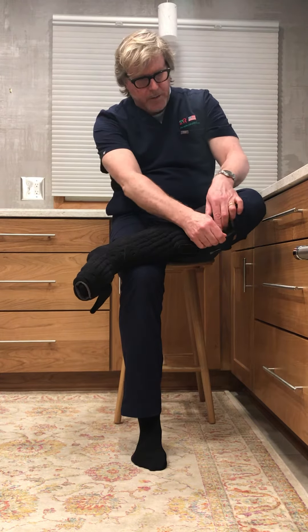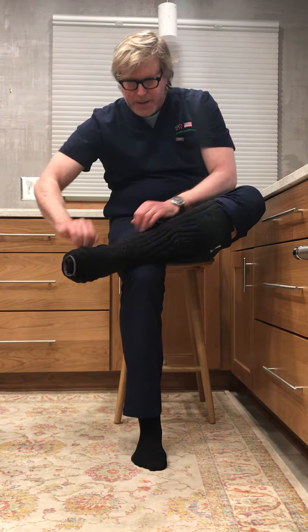Before you fasten the wide tabs, I like to fasten the ankle first and firm up the top of the calf a bit. Then I can go through to fasten my wide tabs.